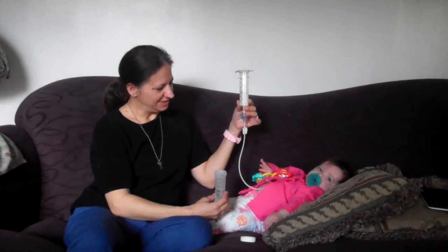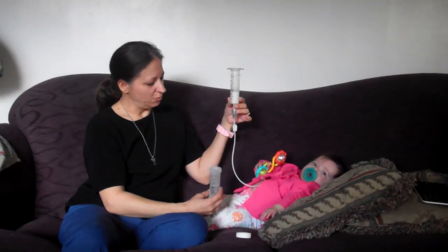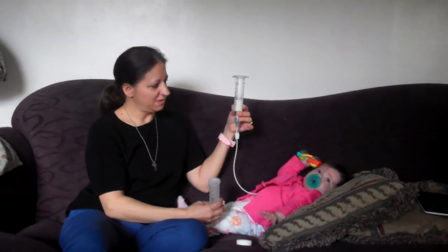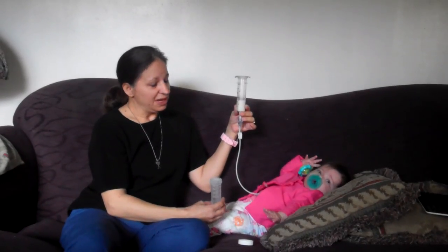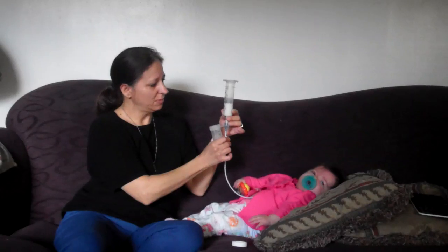Her GI doctor did say that we could hook her up to her tube before she eats. And if there's any air in her belly, that it will come out before the feeding.